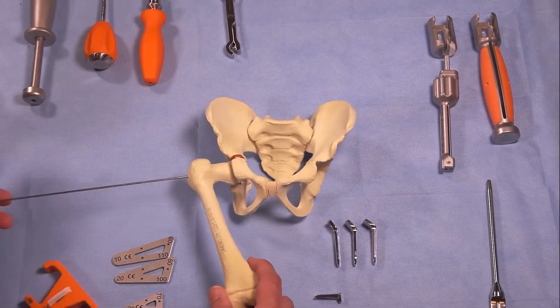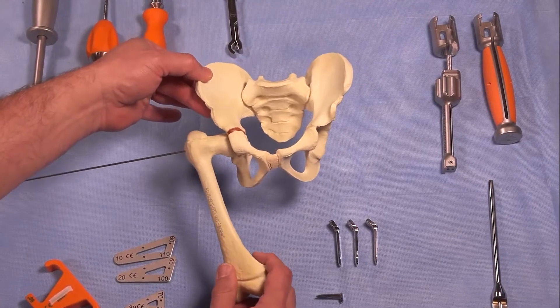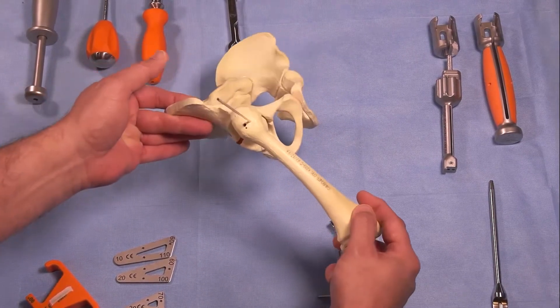This is our model representing a congenital femoral deficiency with severe coxa vara, some external femoral torsion, and an extension-type deformity.